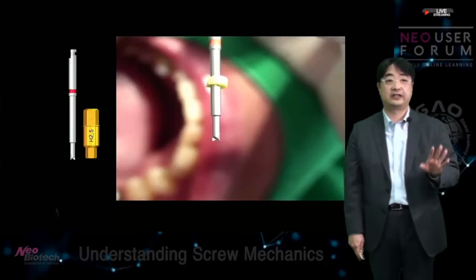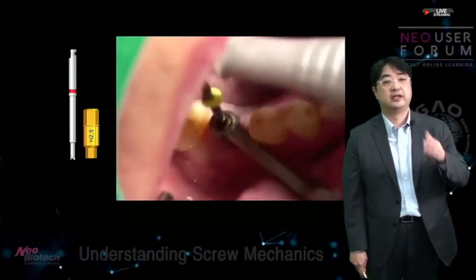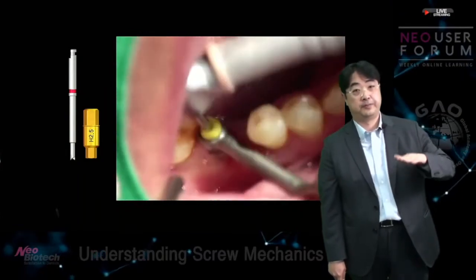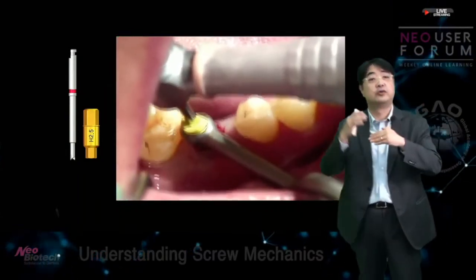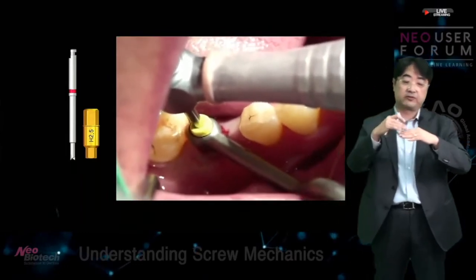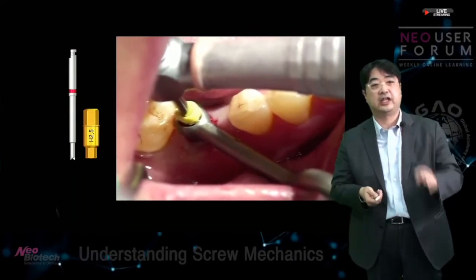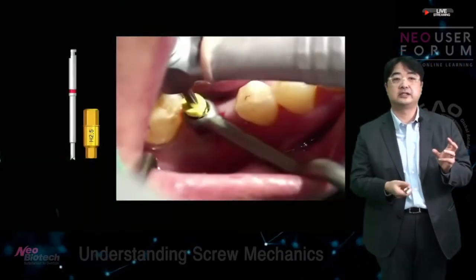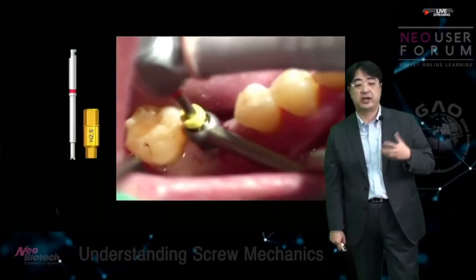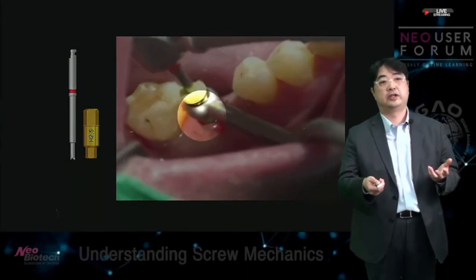it fits the connection. Then use the claw drill with slow speed, and the screw will go up. It catches with the two legs, because with an abutment screw fracture, any part has a rough surface. As you see here, use the anticlockwise rotation, then the screw will come out. You see it's moving up like this.